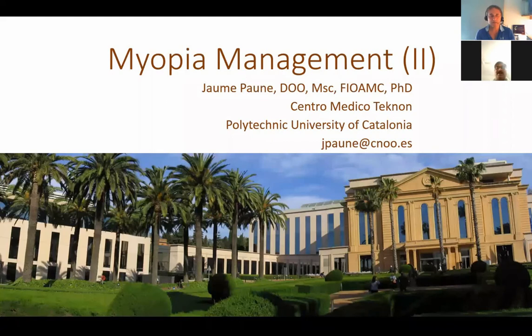Not for contact lenses, anyway. When you are using soft contact lenses with peripheral addition, peripheral refraction or gradient refractive lenses, you are using a kind of bifocal or multifocal lens. So you are making some change in the range of accommodation provided by the lens, and we have no trouble with this. We are using atropine and we are not looking so much at this unless the child has trouble in accommodation. You can do some visual therapy there if the accommodation is very reduced, but we don't look at that point.